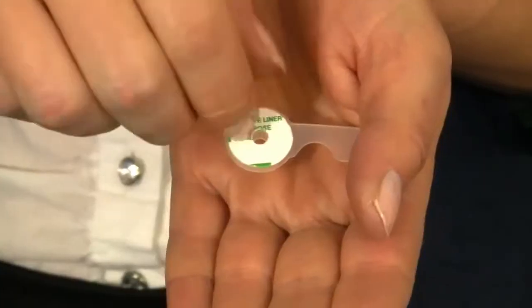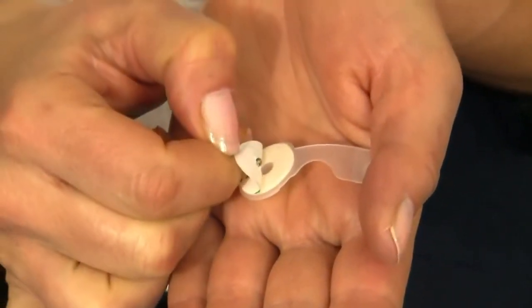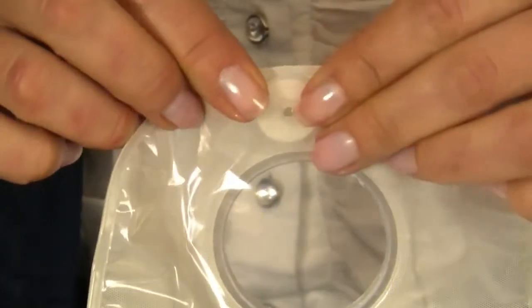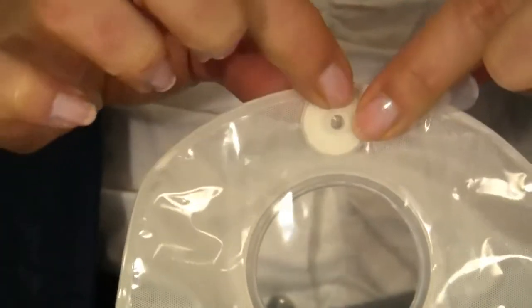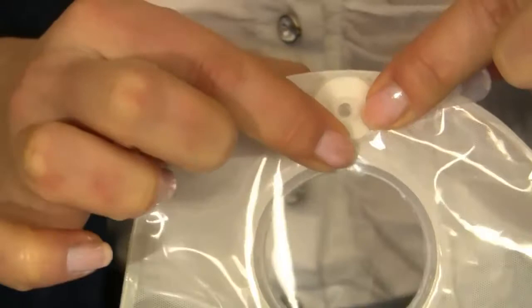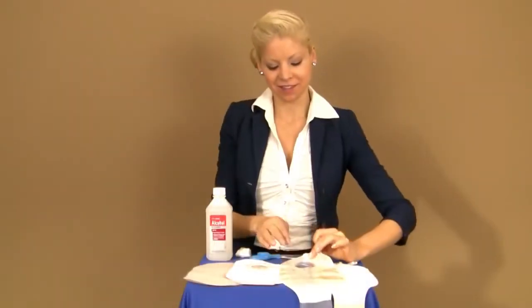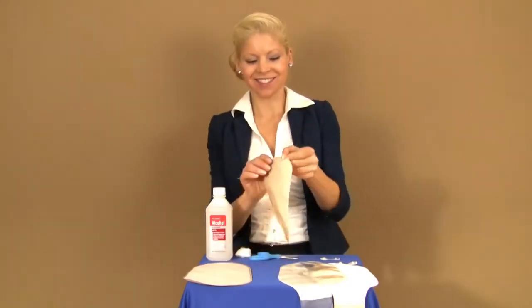Remove the green and white backing from the OstoEasy Vent. Attach the OstoEasy Vent horizontally to the newly cleaned area of your pouch and press firmly all the way around. The OstoEasy Vent will adhere to your pouch immediately, but we recommend 24 hours for the OstoEasy Vent to completely bond to your pouch.